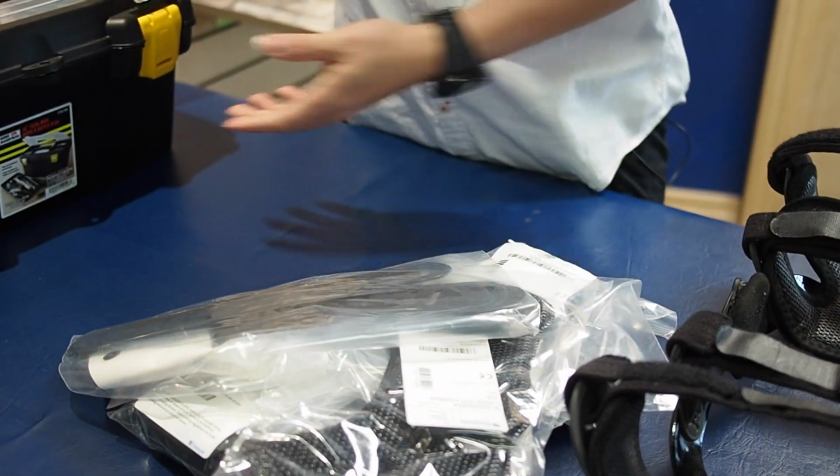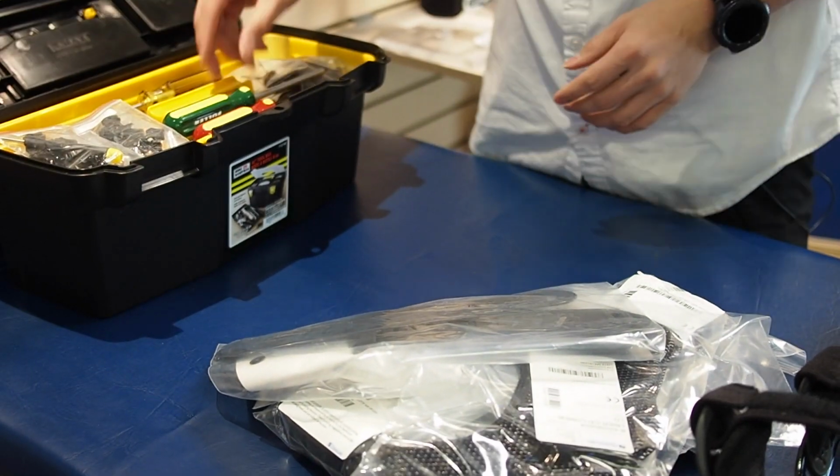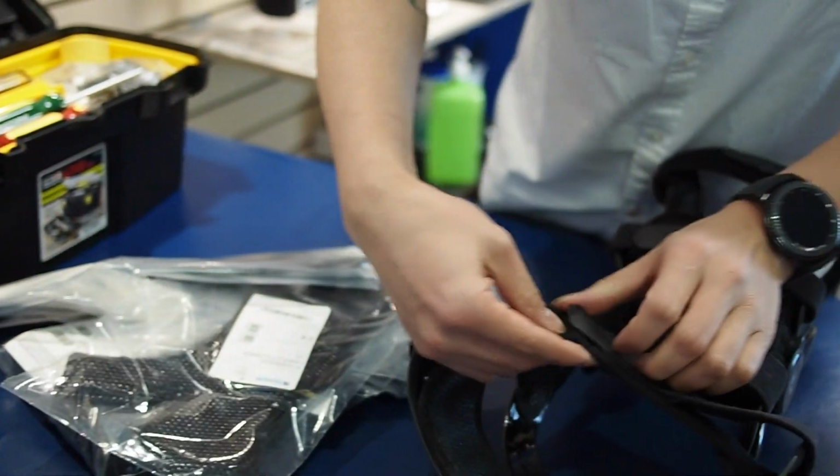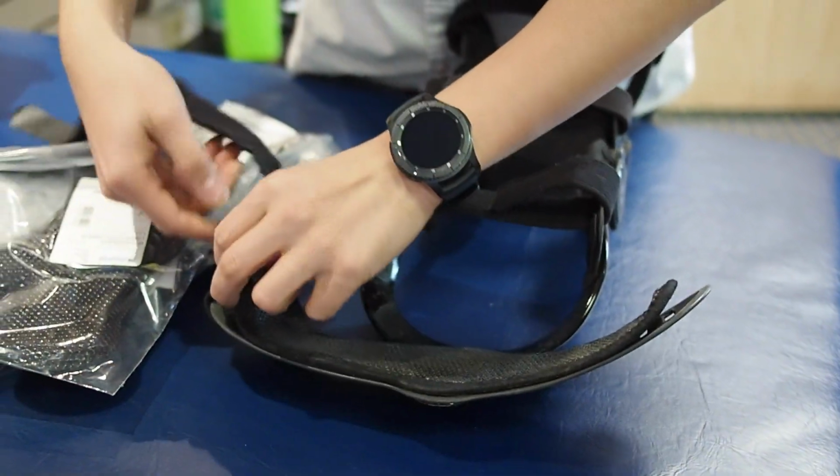the straps. Right now in this package, I'm going to pull out all the parts, and luckily this brace is field serviceable, so I can do this all in store just to save us time from shipping. I'm going to take all the parts off, and this is how we can do that. Everything is completely removable.